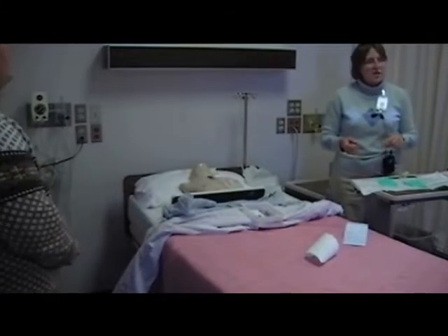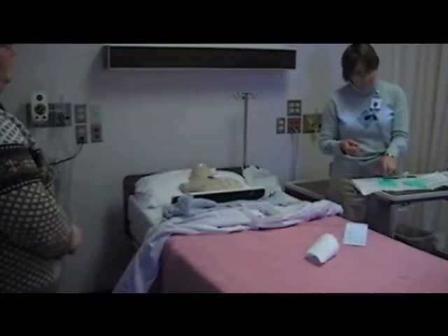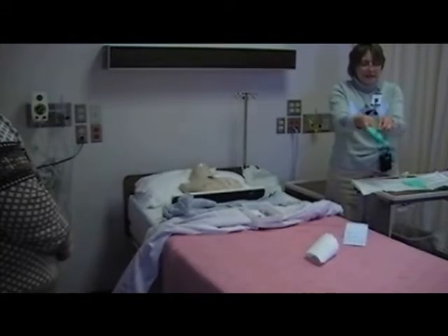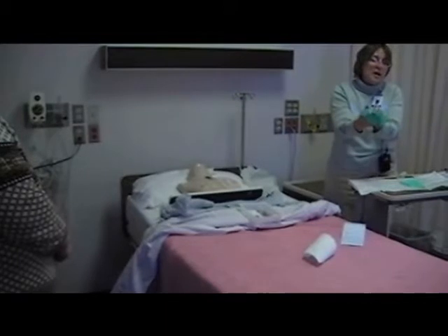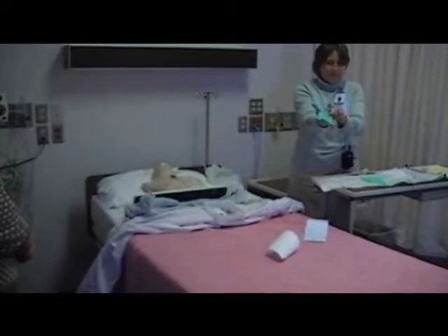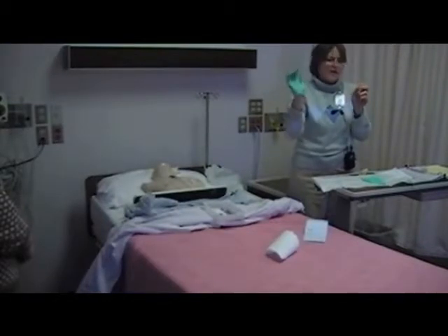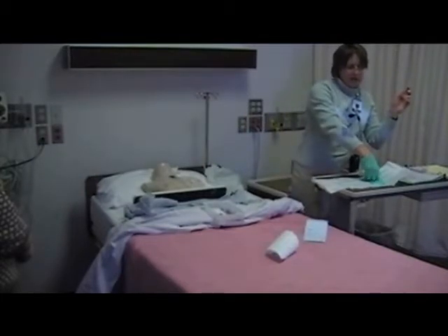Okay. Which hand do you usually put on first? Dominant. Okay. And please hold your hands high enough off of the table so that you're not going to contaminate it on the sheet. Okay. The part of the cuff that actually tore is way far down. Let me get on my other glove and we'll see how these look, if I'll be able to use them or if I should get a new pair.